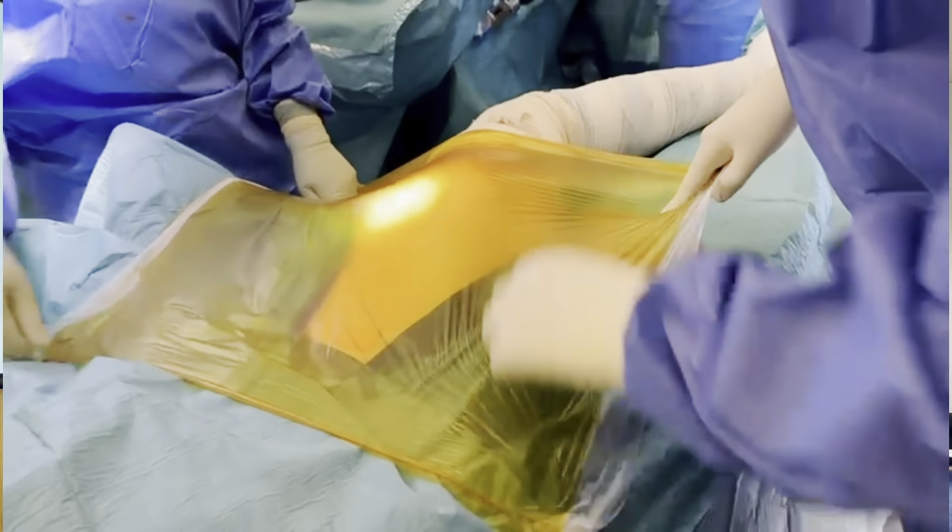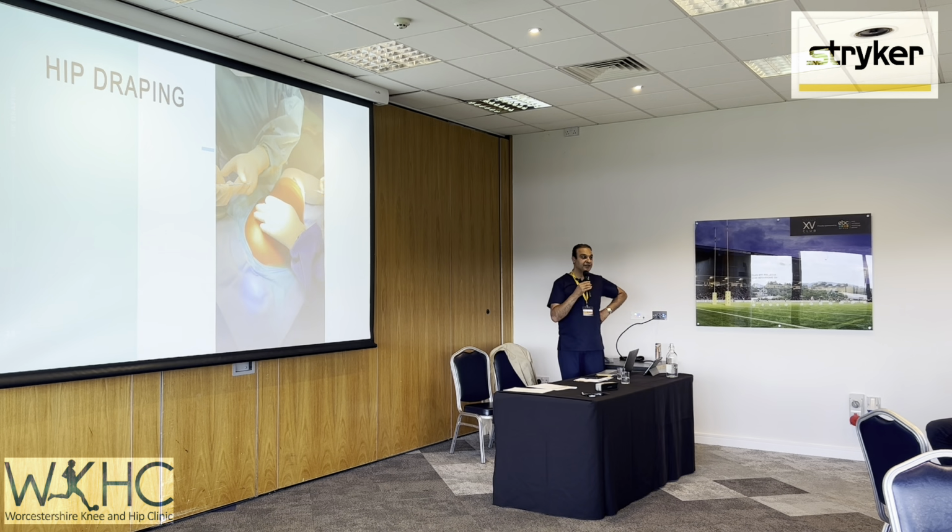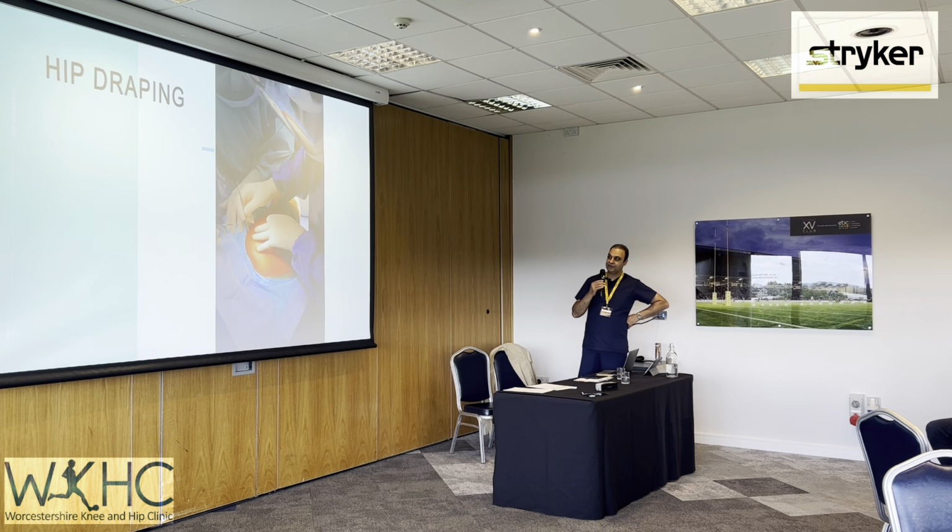So that's pretty straightforward. I recommend using an 11 blade to put the pins in, because with the 11 blade, you can actually feel that you're going down onto the bone. So we make the incisions on the actual bone. And with the 11 blade, don't use those big 23, 22 blades, don't make big incisions. 11 blade, feel the iliac crest.